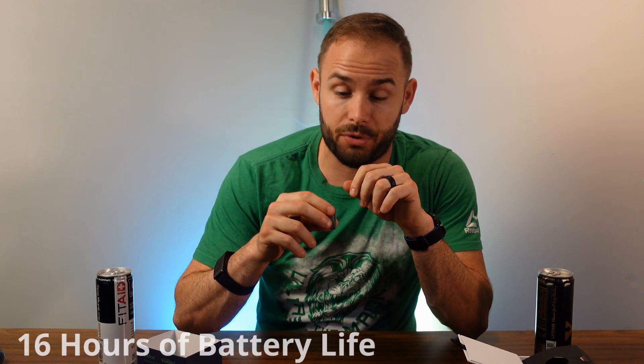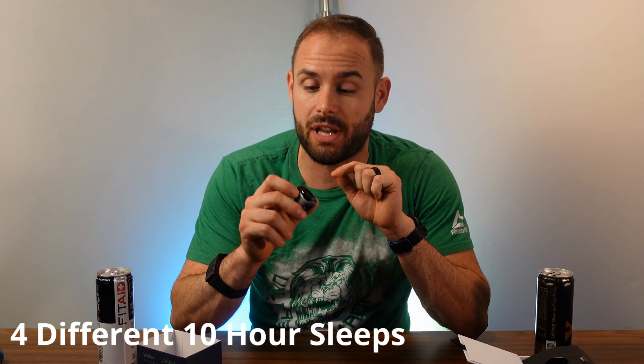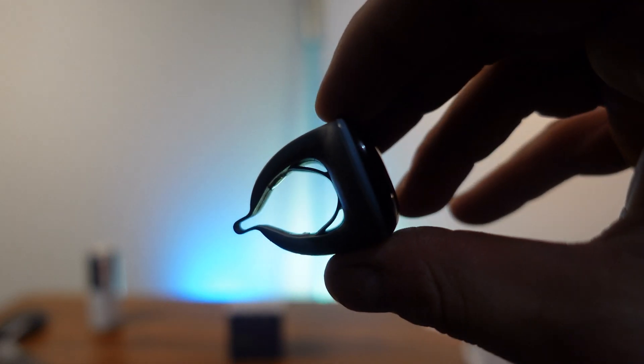It charges via micro USB and can get up to 16 hours of battery life, so sometimes you can get up to two full days of sleep tracking. It has built-in storage, so it doesn't have to be hooked up to your phone — it can store up to four different 10-hour sessions in its memory. It has an SpO2 sensor and a heart rate monitor built in, with a little button on top to go through different screens. This is a one-size-fits-all ring that expands a lot and is meant to go on your thumb or index finger.